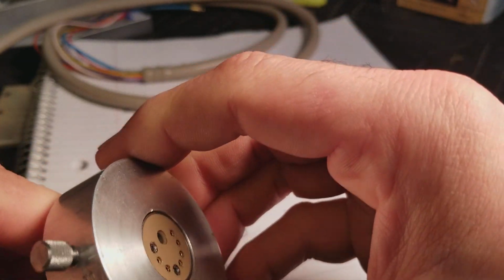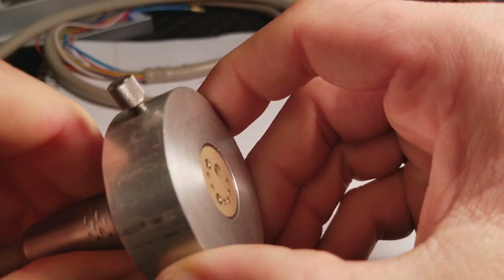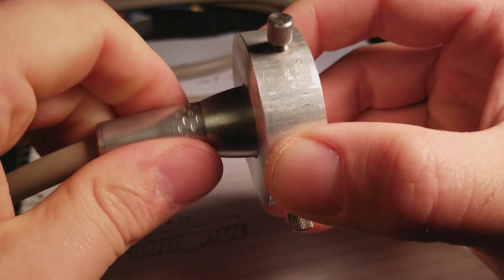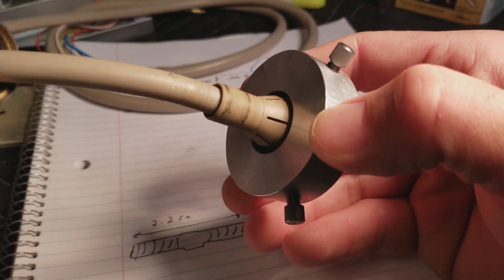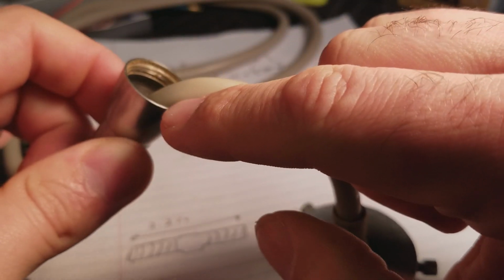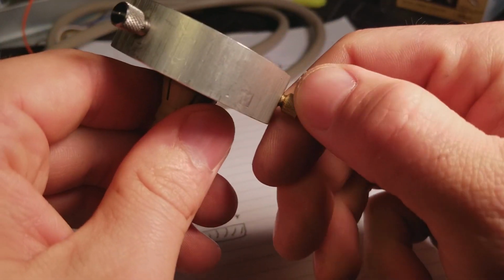Now I've done this twice. I found one of them to be very easy to take apart. The other one was a little more difficult. It's like there was corrosion or rust or something. So anyway, now I'm able to spin this component while this wrench holds the inside piece stable. You'll then get this. So this is that corrosion I was talking about. I found this much more difficult to get off than the other piece.